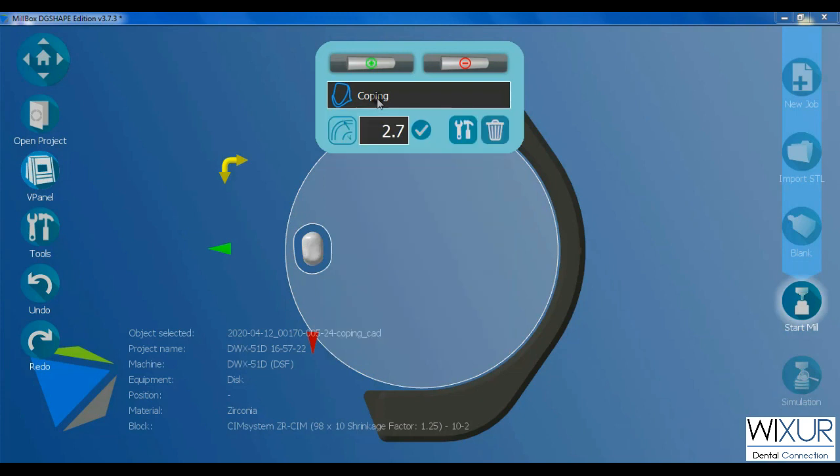In the black tab, I can change the type of the job that was defined before. The number shown in this field represents the offset area around the coping, and by default it is 2.7 millimeters.